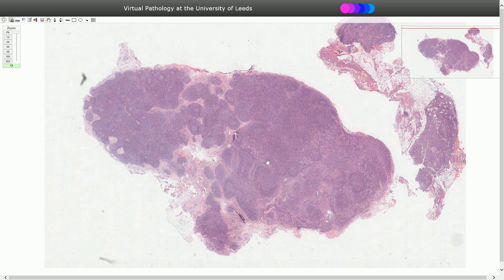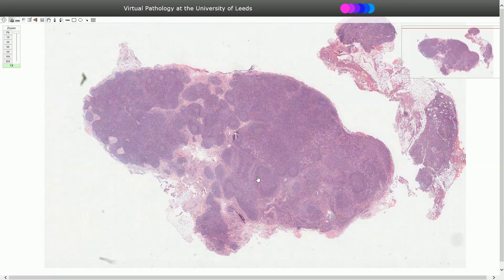Here we see a lymph node affected by Toxoplasmosis. The overall architecture is preserved, and we can identify three important signs that define Toxoplasmosis. The first is reactive follicular hyperplasia — enlarged follicles with activated germinal centers.